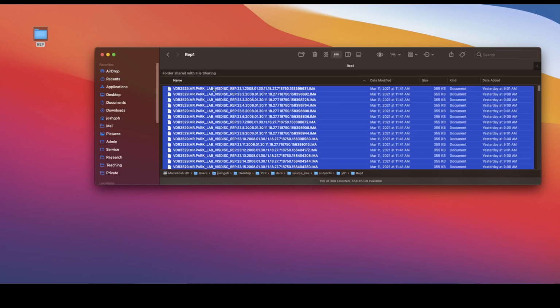So you can imagine that if one file has many 2D slices, that means one file is effectively a 3D image, with three-dimensional information in there. Then it goes on to the next file, which is itself also a 3D image, and another 3D image, and another 3D image, so that the whole sequence is a 4-dimensional data set.